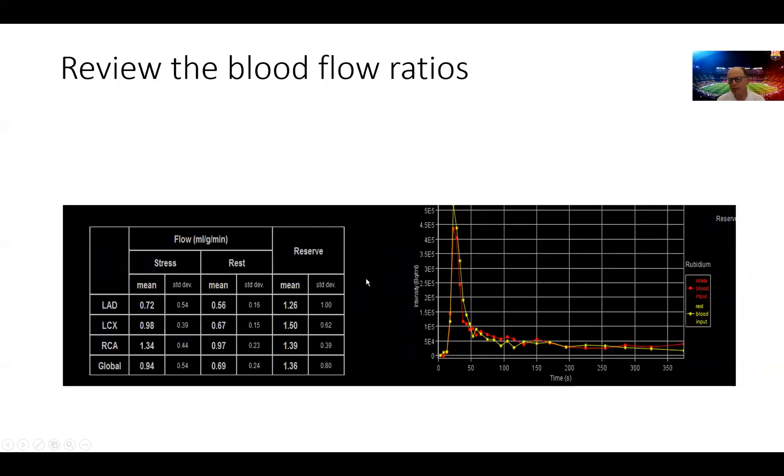The next stop is to do the flow ratios on these patients. Here we see a rest flow ratios that are reduced in the CIRC and LAD territory, normal in the RCA.